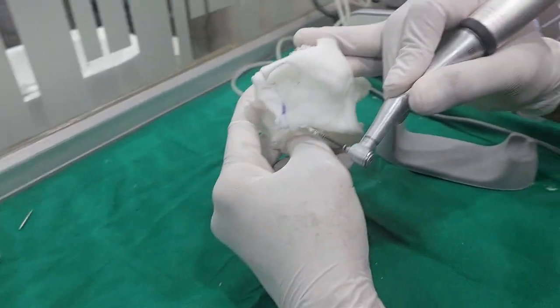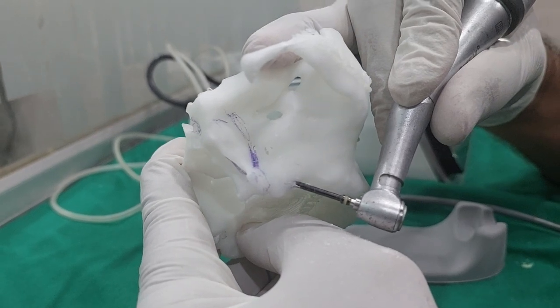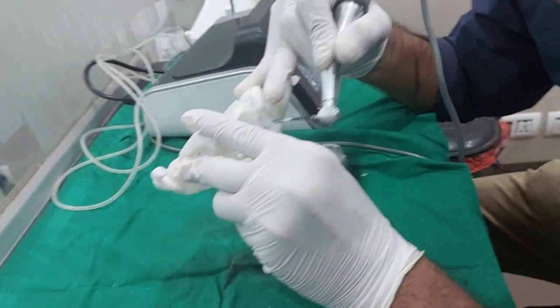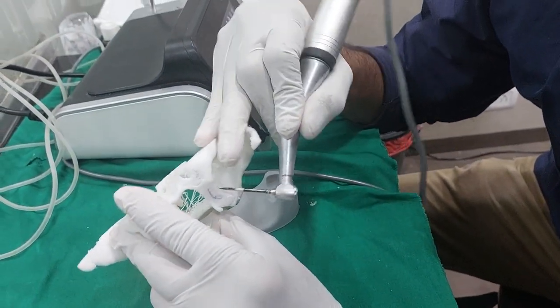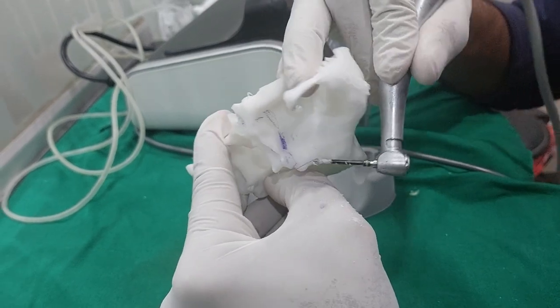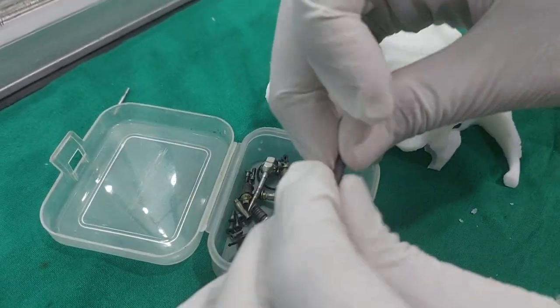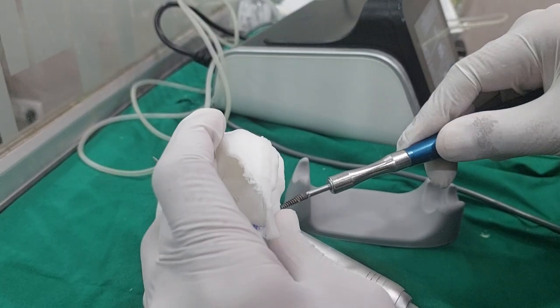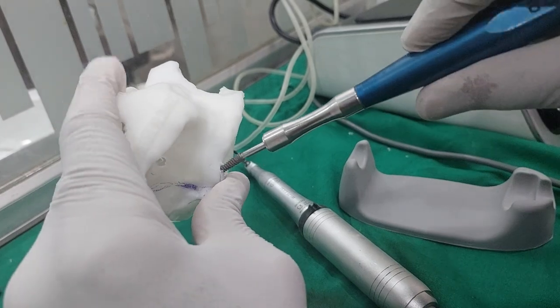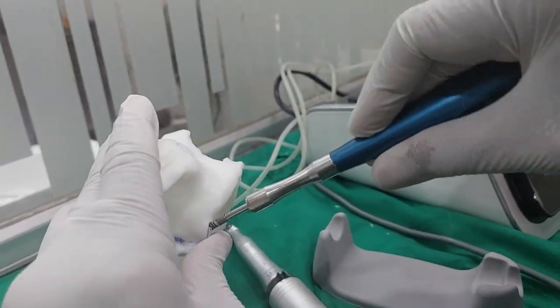I have reduced my speed because clinically in a patient's mouth the bone density is different - it is soft. So now I will do the drilling again. See, I have reached here. It is piercing the lateral pterygoid plate. There is no problem with this also. Now I will take the implant. This implant is an active implant with sharp threads and a pointed apex - that is why I am selecting it. See, the tuberosity has got a crack because it is an STL model. In the mouth it can also happen but it will heal - don't worry. You can choose the length accordingly.